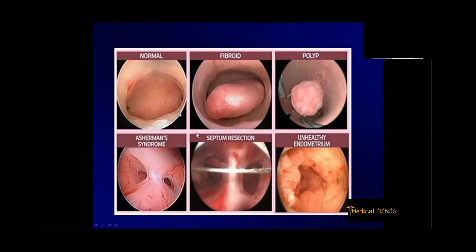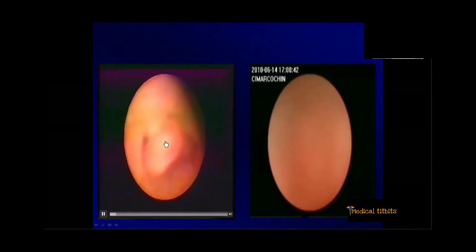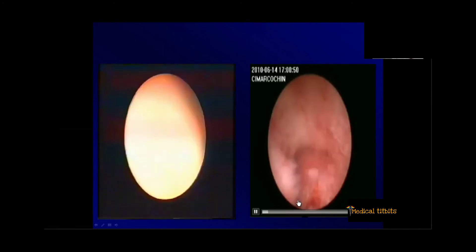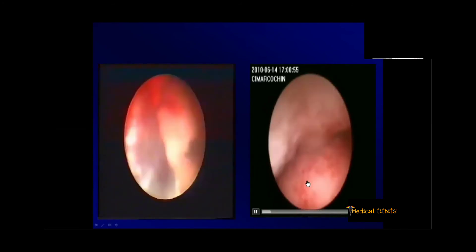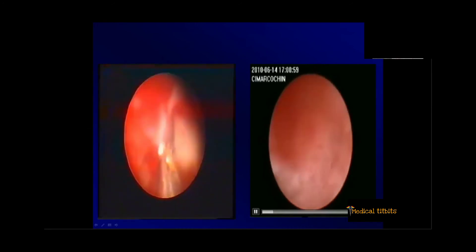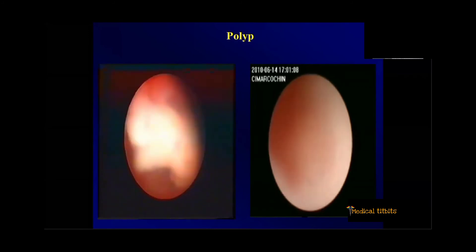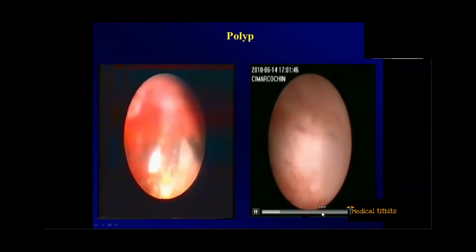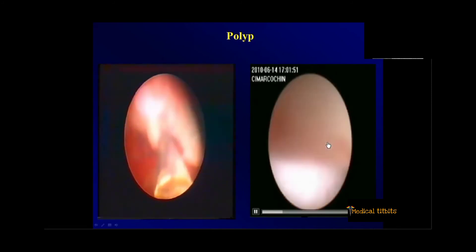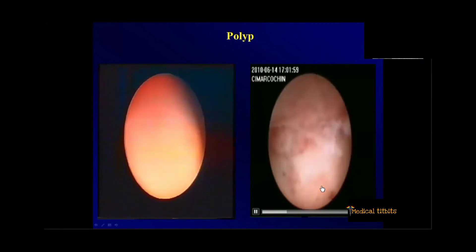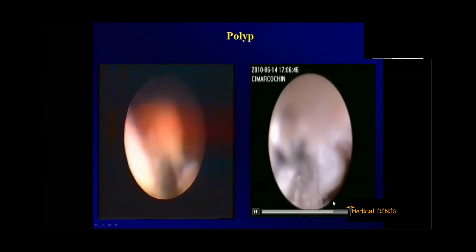In infertile and IVF patients, what we are concerned about are abnormalities inside the uterine cavity — like fibroids, polyps, adhesions, septum, or irregular endometrium. This is a picture of a typical polyp; if you want to remove it, you hold the base and excise it. When the distension is inadequate — if the pressure is not adequate or if there is fluid leak from the cervix — you won't get a proper view of the uterine cavity. But with proper distension, you can see a small polyp on one side of the cavity, which you would miss without adequate distension. The same lesion can be removed in the same sitting.